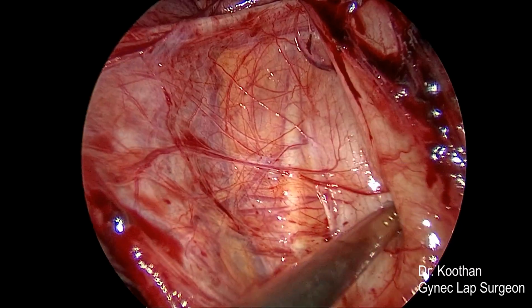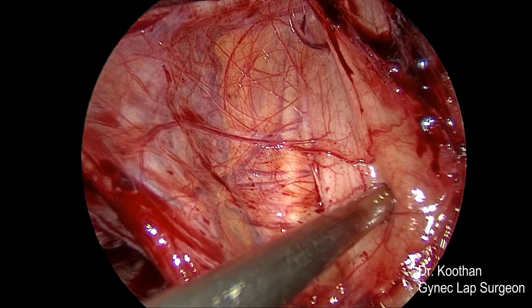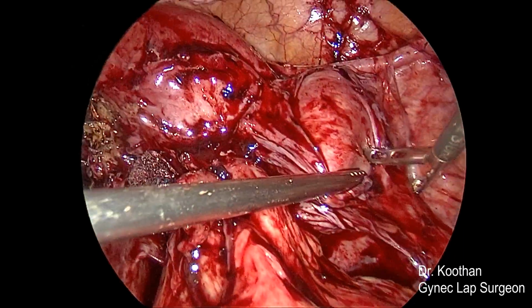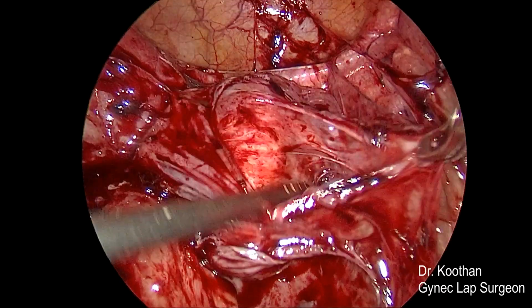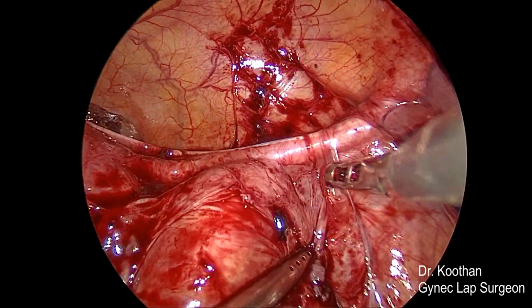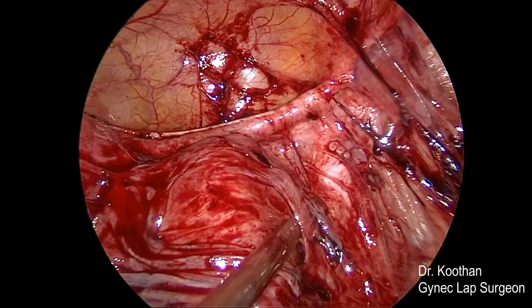We are searching for the ureter. We have actually dissected the ureter at the level of the pelvic brim, and the ureter is under our vision.